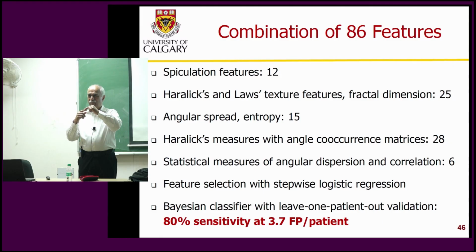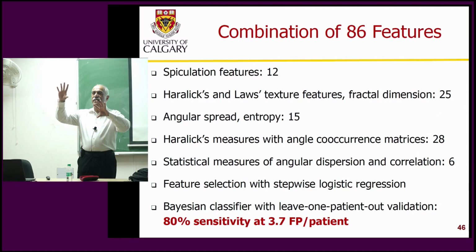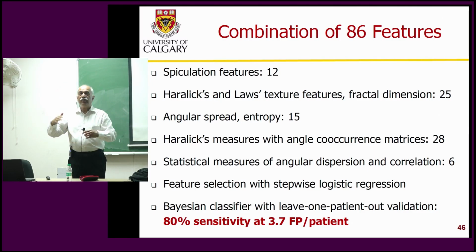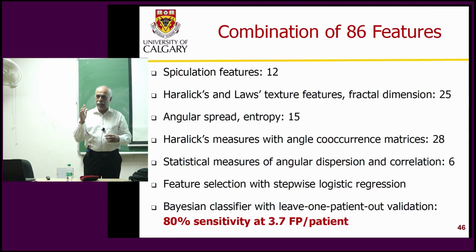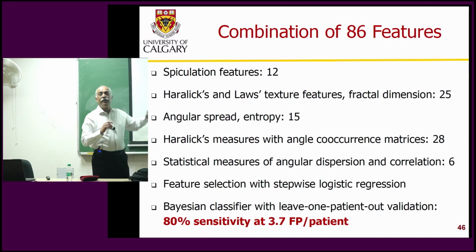They should all be similar if there is coherent orientation. It's like coherence. If they are scattered, then the angle co-occurrence matrix will be scattered. If they have similar orientation, we get large values along the diagonal, similar to the gray level co-occurrence matrix, but angle co-occurrence.